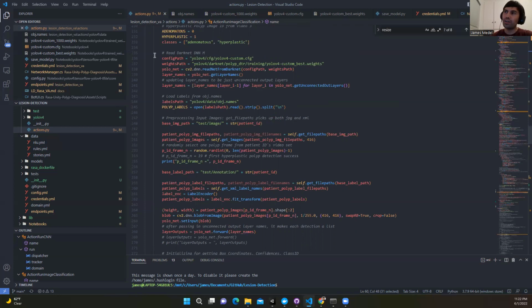So we need our hyperparameters. That's defined in the YOLO v4 custom configure file. And then we also need our weights path. The weights, throughout training, what YOLO does is it saves weights. Those are just like saving instances of the model.